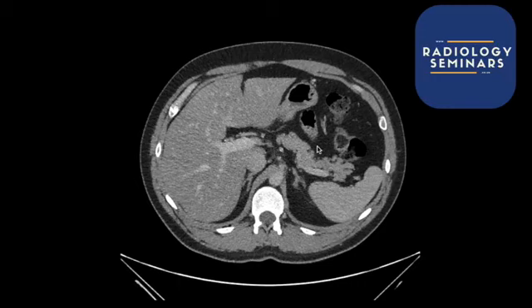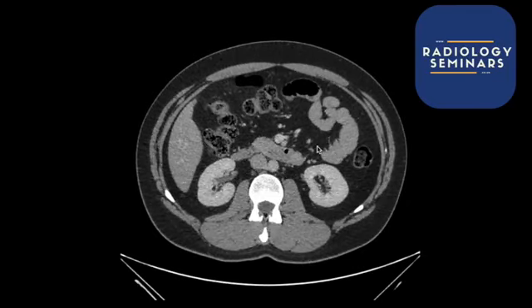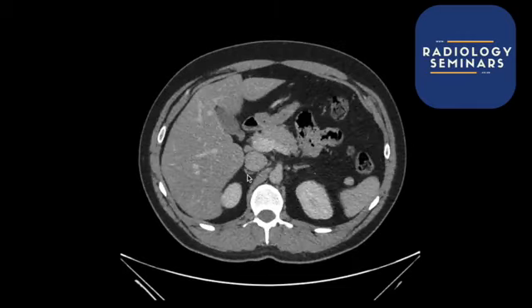I think it's about 70 seconds. So you inject the contrast, you wait about 70 seconds, and then you take that scan, and that should be sort of the delayed portovenous phase of the image. Sometimes you want to go even more delayed than that. You may leave it for 10 minutes, and in that situation you'd be going for a very delayed scan where it's all been filtered out by the kidneys and it's gone through into the ureters as well. So that's kind of a really basic way to know what kind of scan you're looking at from the outset.